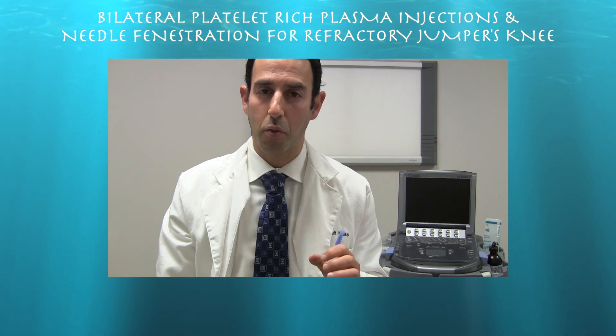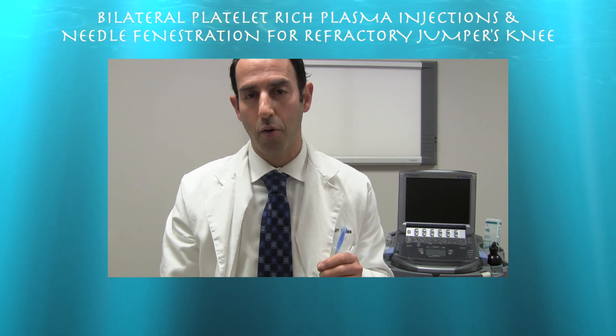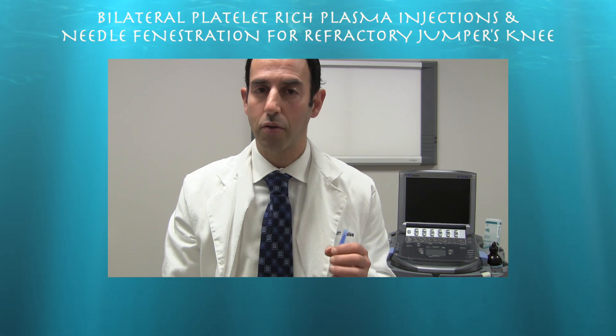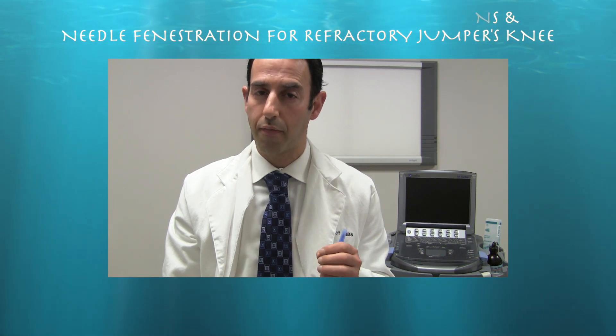This is a 23-year-old Division I college basketball player with refractory bilateral patella tendinosis going on for roughly four years. We did bilateral patella tendon PRP injections under ultrasound guidance. We also did a tenotomy/fenestration in addition to the PRP injections, and the patient did extremely well from this procedure.